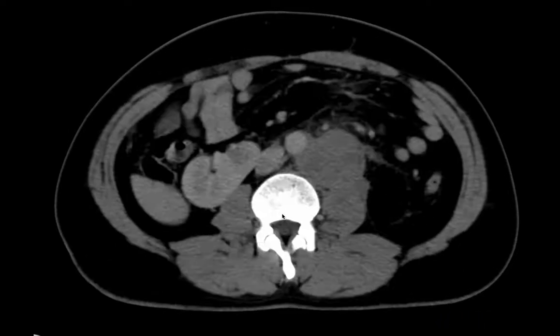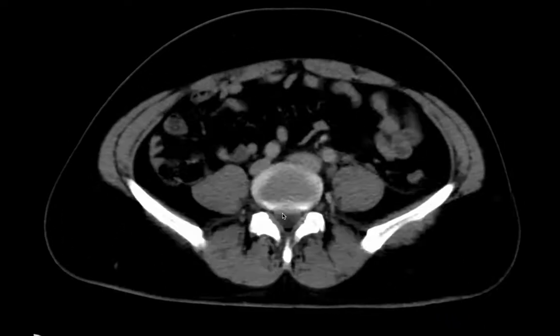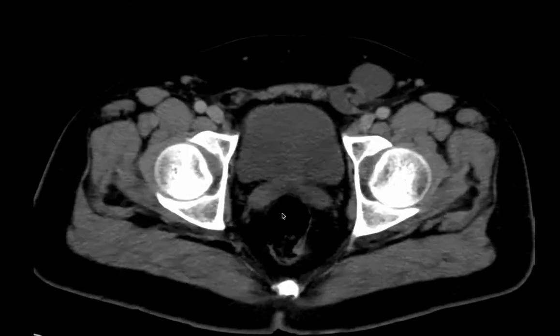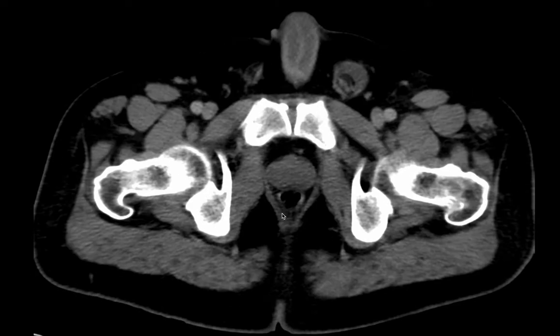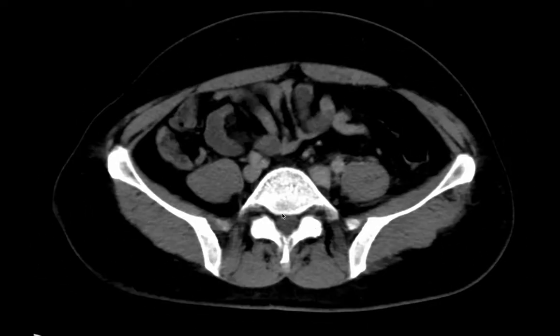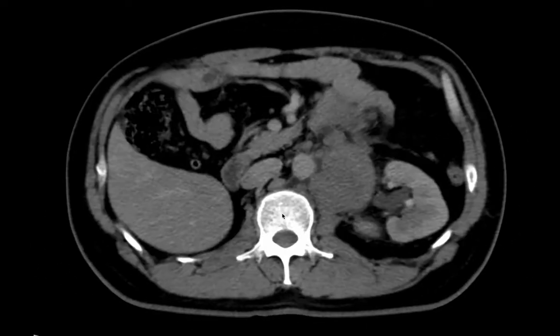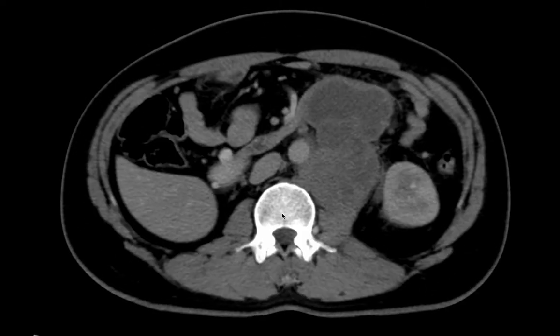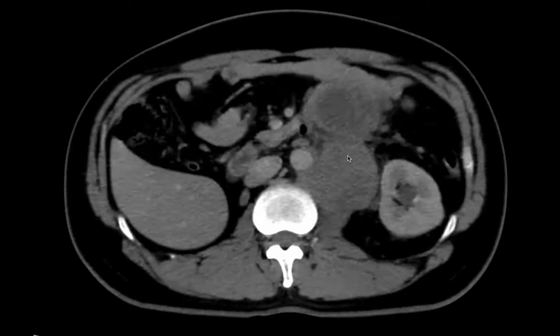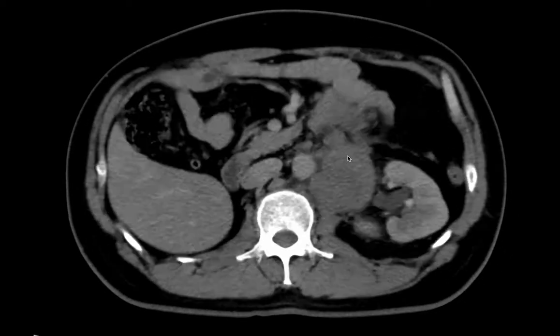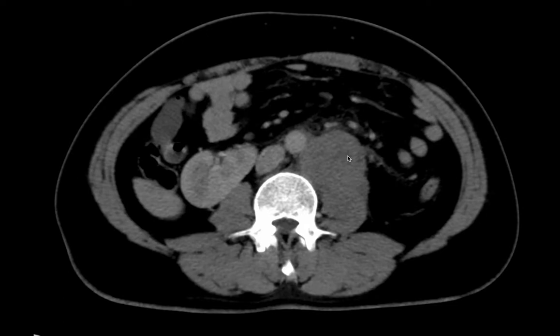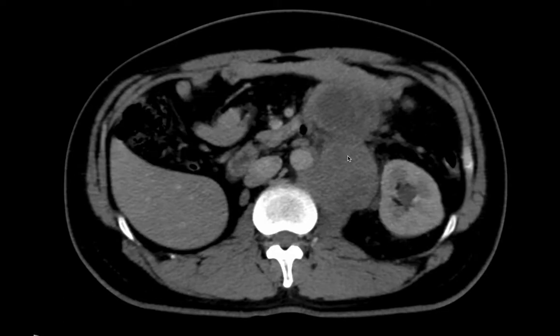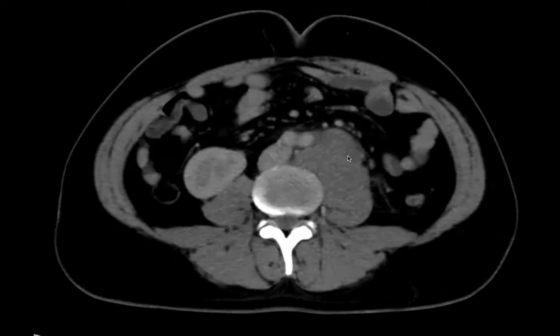CCT abdomen, portal venous phase of a 33-year-old male patient in whom ultrasound has detected multiple retroperitoneal lesions. The largest lesion is seen at the renal hilum in the left para-aortic region, displacing the bowel loops anteriorly.